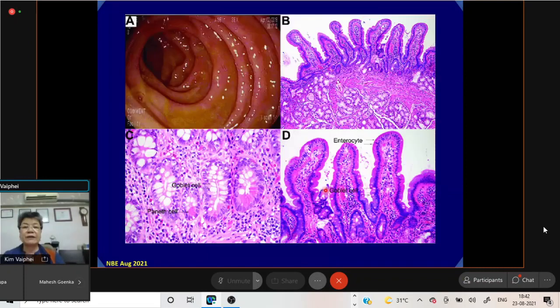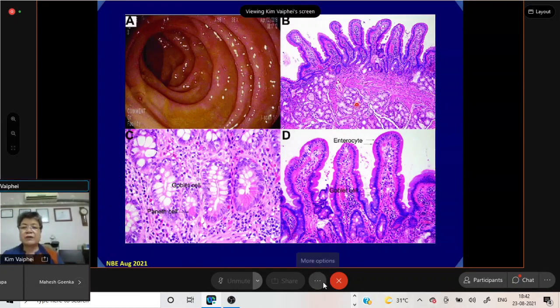And now I think that much for the stomach. Now we come to the duodenum. And so you all would be better versed than me. This is the duodenal mucosal folds, and this is the Brunner's glands. Small intestine cannot be differentiated on endoscopic biopsy one from the other, except by the mere presence of these Brunner's glands. So presence of the Brunner's glands tells us that this particular biopsy is from a duodenum, not otherwise. All would be looking the same.